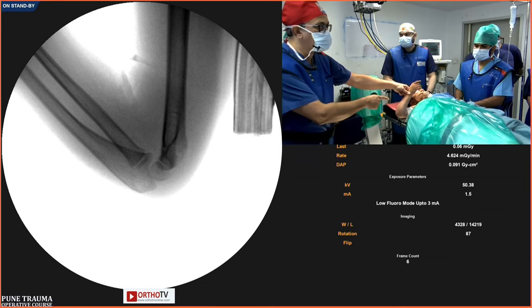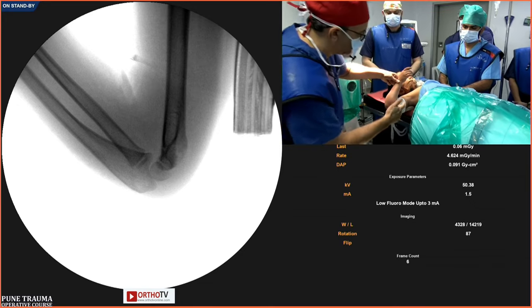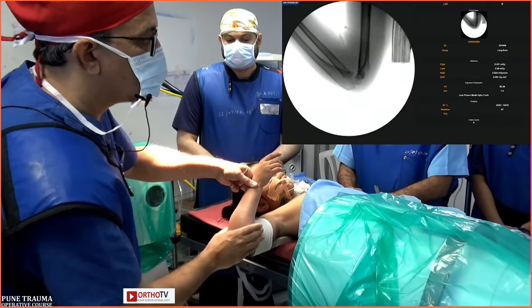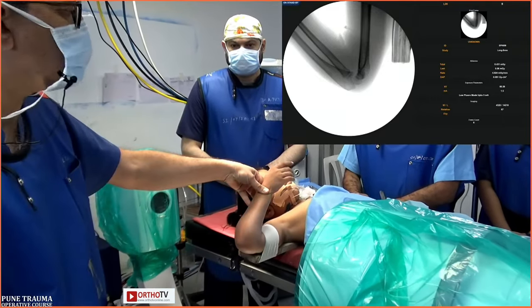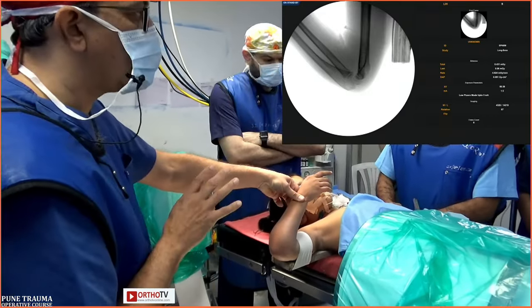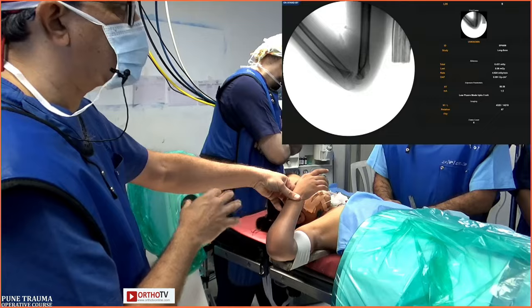Can you see the clinical image now? Lovely. See the acute flexion. Now imagine giving a cast in this flexion. It's just not possible that we'll be able to get away without any kind of a complication. So now that I have confirmed my reduction, the next step is going to be preparation and draping.